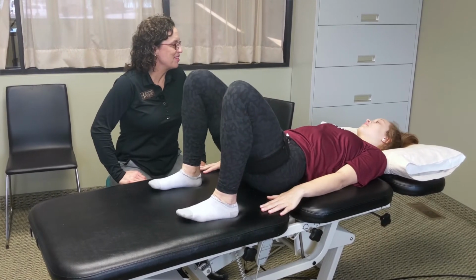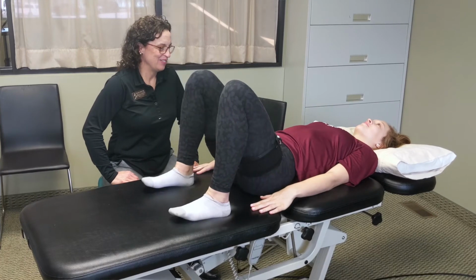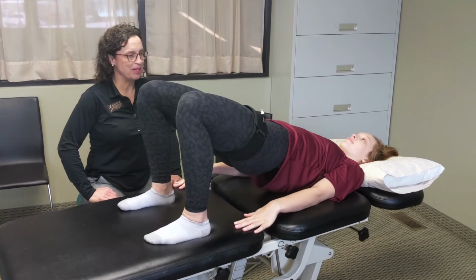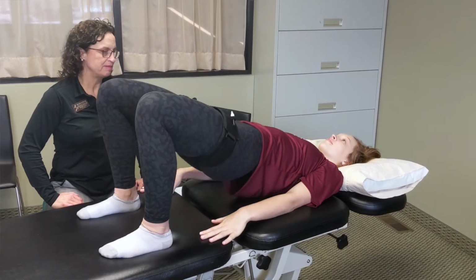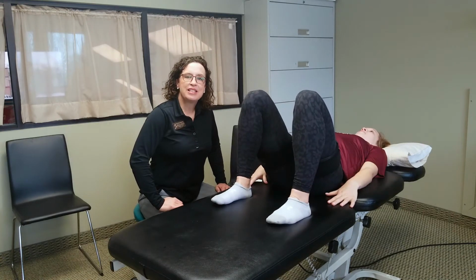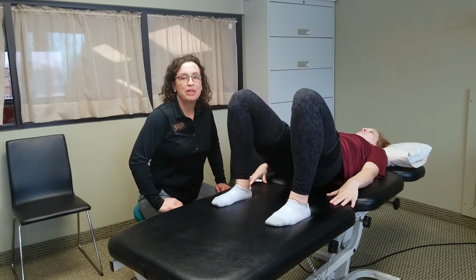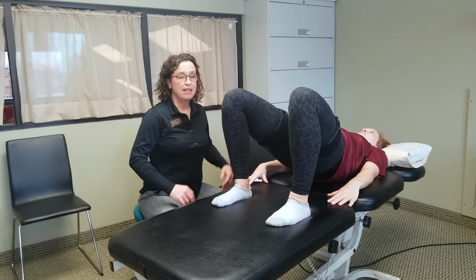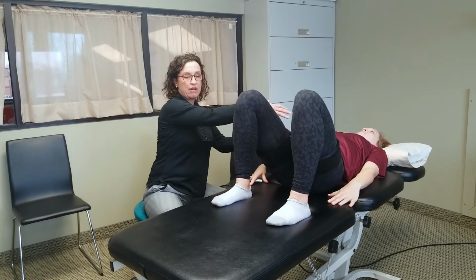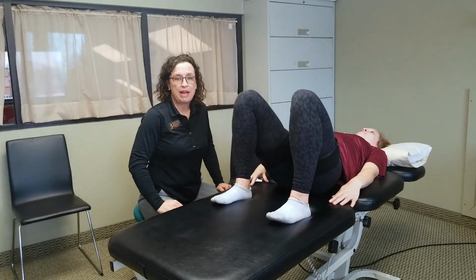Do you remember the first time when you did this? Yeah, it was really hard. Really hard. But you were just coming back from an injury, right? Mm-hmm. So that would make sense. Again, this is an example of a relatively low intensity exercise with blood flow restriction therapy. It can be used all throughout the body, and the benefits aren't only in Rachel's legs, but the benefits even are in her hips, near the cuffs, and also in her aerobic capacity.